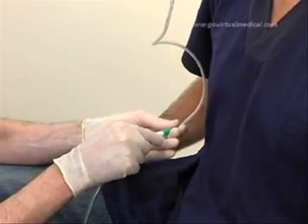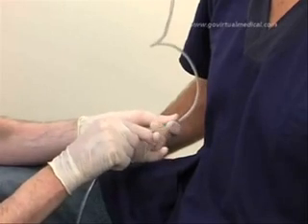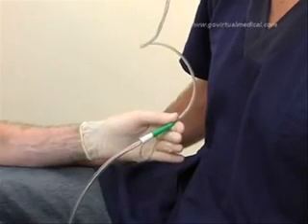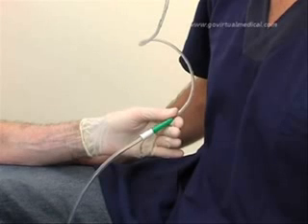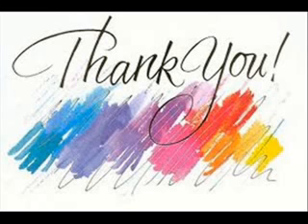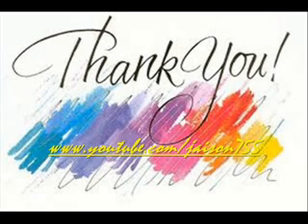Attach the bag to the tube and allow for free drainage. Document the procedure, its indication, the size of tube used, and the amount and nature of the aspirate in the patient's records.